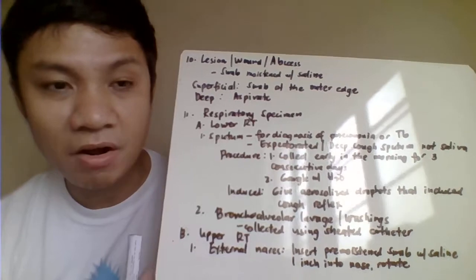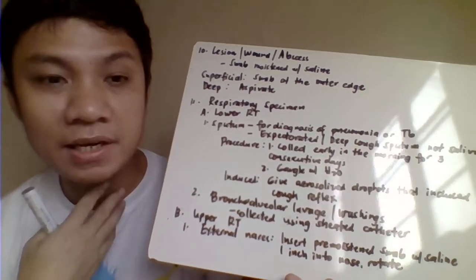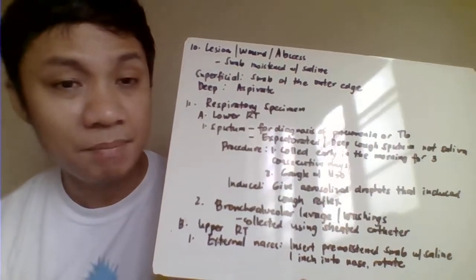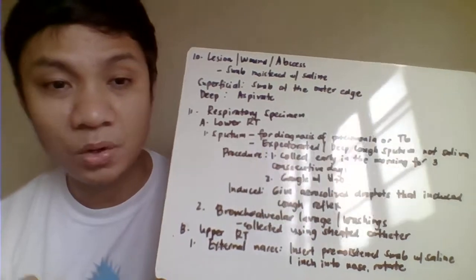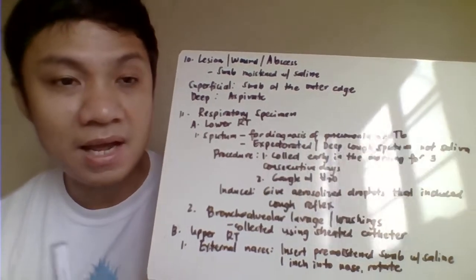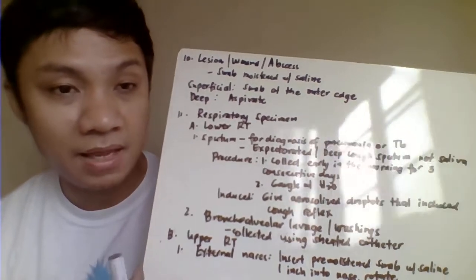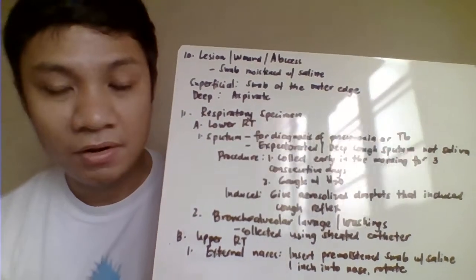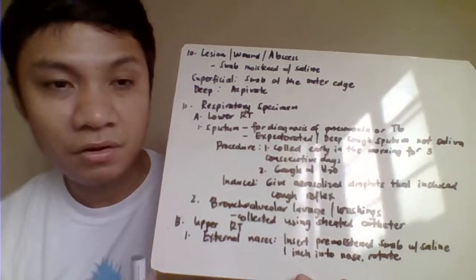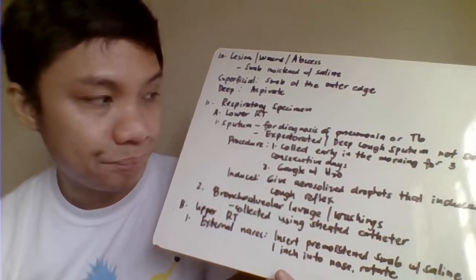It's because of the irregular pass out of your microorganisms. So baka ngayon nag-collection ng sputum tapos baka walang organism, pero meron siyang Mycobacterium tuberculosis or the patient's already been infected. Only that, that time na nagko-collect siya, hindi napasama ang ating bacteria. So why you are collecting the specimen 2 times, 3 times is in order for you to be really certain kung positive talaga siya or hindi.